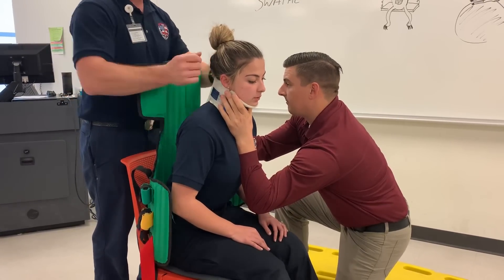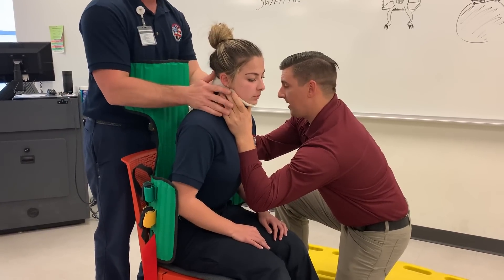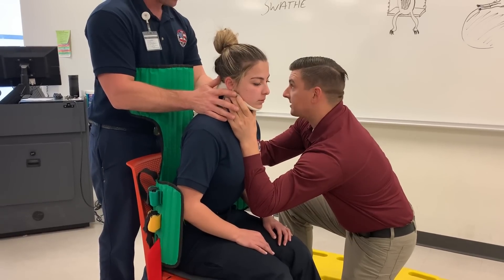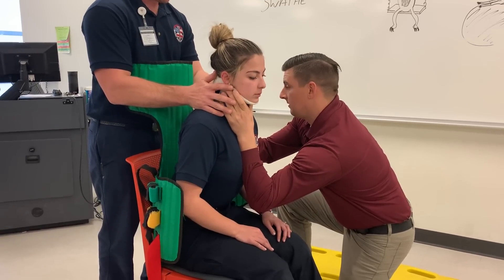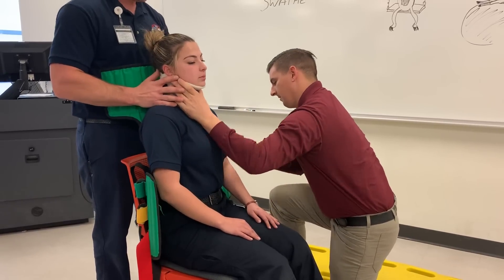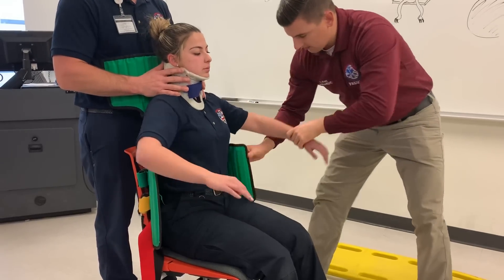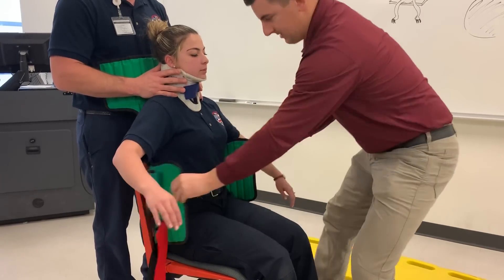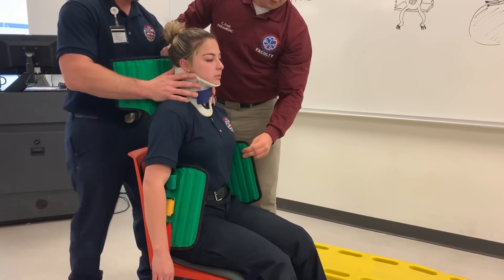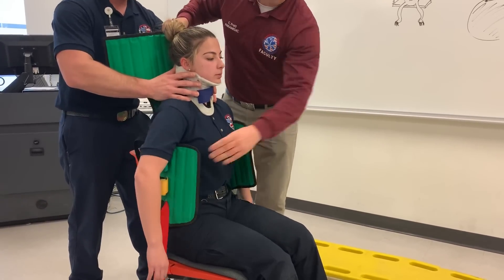Now that that's secure, partner is going to resume C-spine. I'm going to tilt back on the head man's count. One, two, three. The patient is now back. We're going to make sure the KED is tucked up into the patient's armpits.